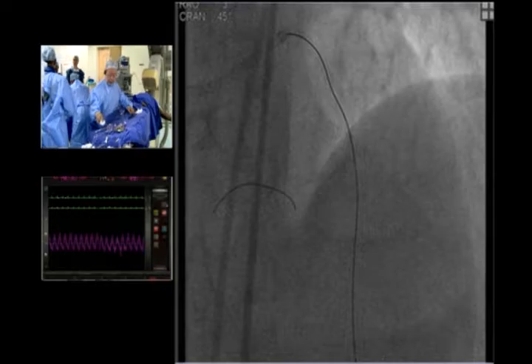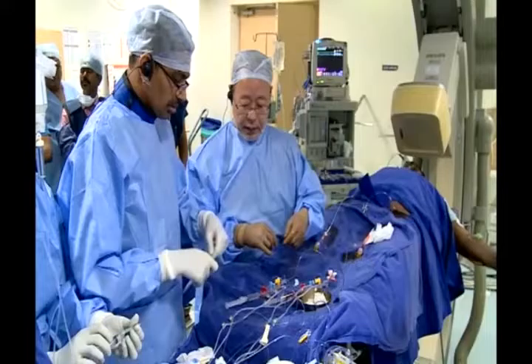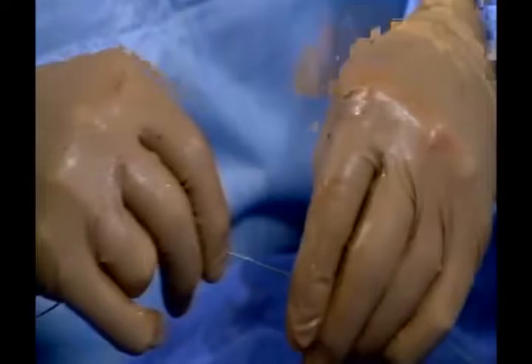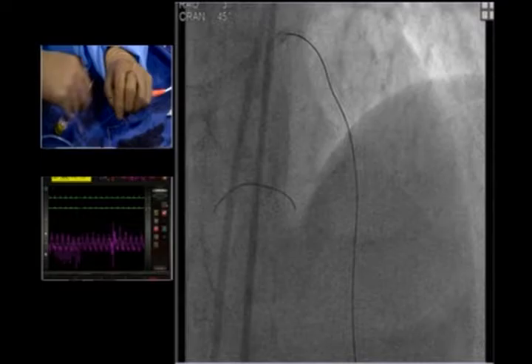So, Dr. Saito, we have about another 15 minutes of transmission time with you. We're going to stay with you for this very challenging case. Thank you. What is your next step here? I think next, I'm taking a 1.1 millimeter balloon, and then if it doesn't work, I will go to the Tornus.